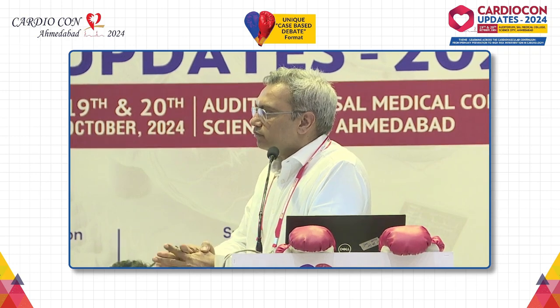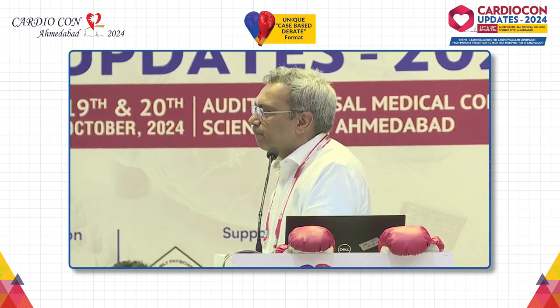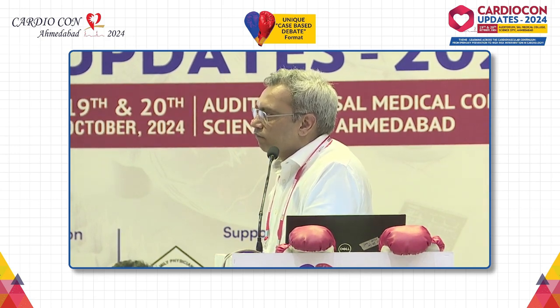The extension of the apical scar in the interventricular septum involving the conduction system, especially the left bundle itself, is the case where just pacing the typical left bundle per se would not give you the adequate parameters we want in terms of conduction system pacing. If there is no evidence of a QR pattern maybe in lead V1, and if at all you are having that on the table, then there is no option. You need to switch over to CRT, as Dr. Sami is mentioning.